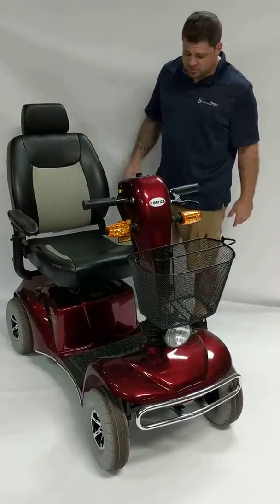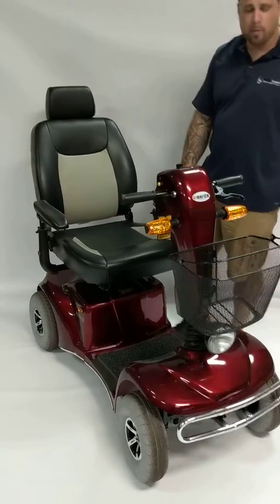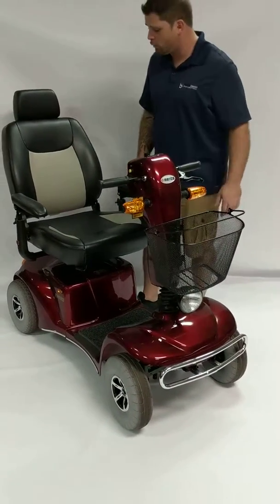It's got a full suspension on there. It's very nice for driving on the sidewalk and on grass and so forth.